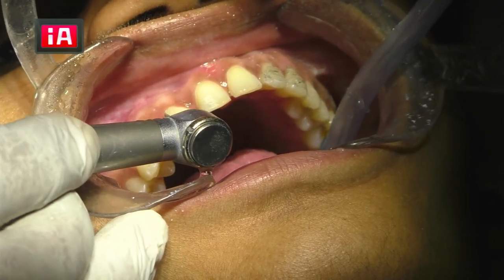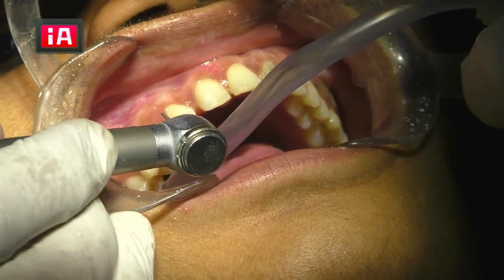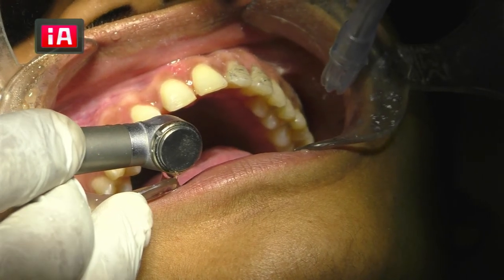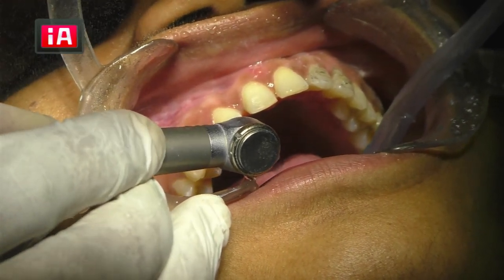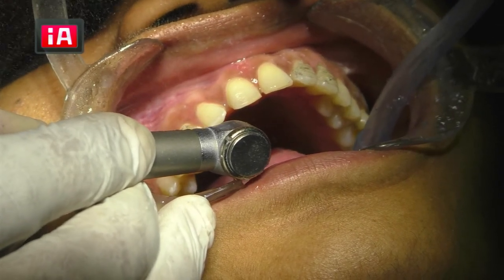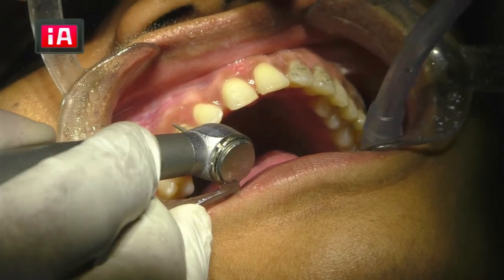Here, since there is already contact, I'm not going to break the contact. I'll just give up the finish line without breaking the contact. Here I'm giving the contact, slightly, and same with the next one.